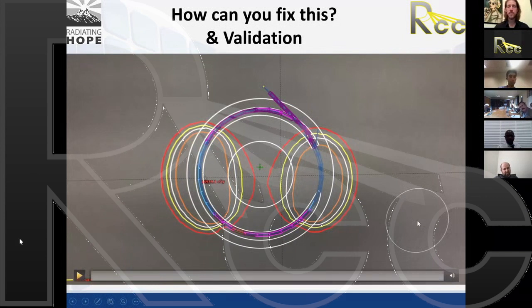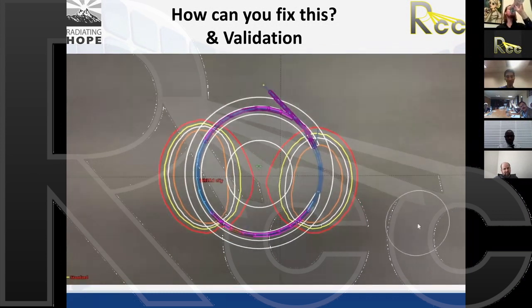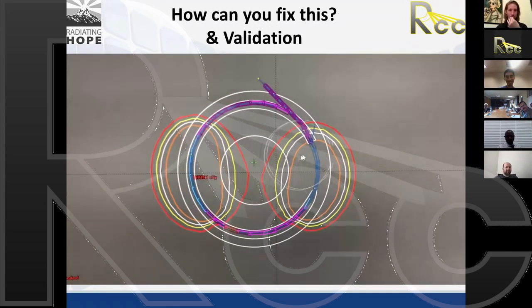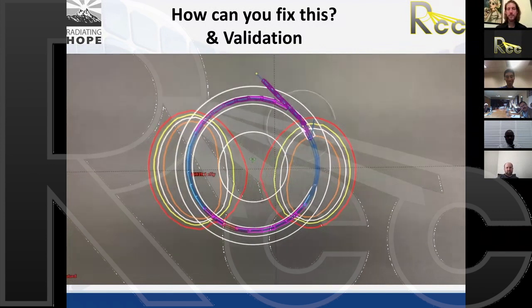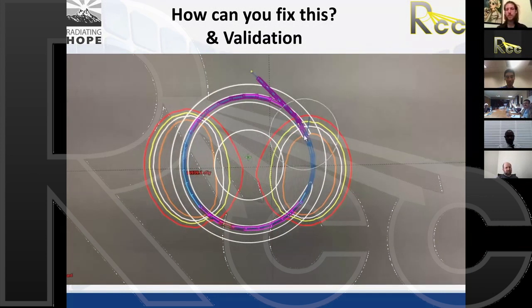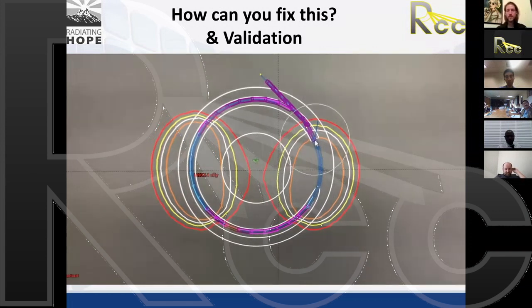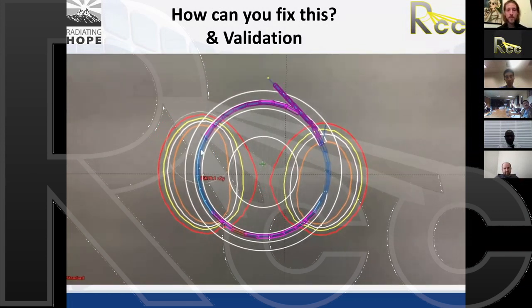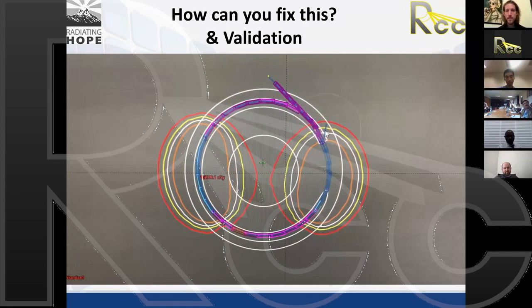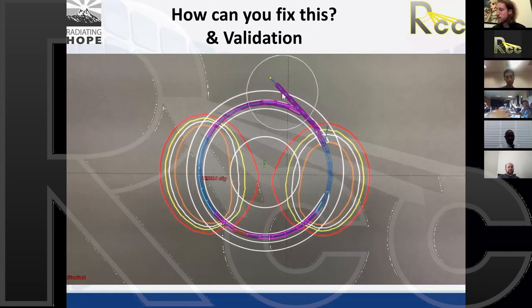Okay, so here we want to discuss the two methods for correcting for a backward stepping system like in the Varian unit. So here I've got a ring, and you can see there's an arrow right here indicating on my planning system that the first reconstruction point is here. You can see the first reconstruction point is at the end of the internal lumen. So it's been reconstructed properly. So if I load on this planning system dwell positions, symmetric, notice there's a slight dip here due to the fact that sources are leaving this plane, as discussed on the PowerPoint presentation.